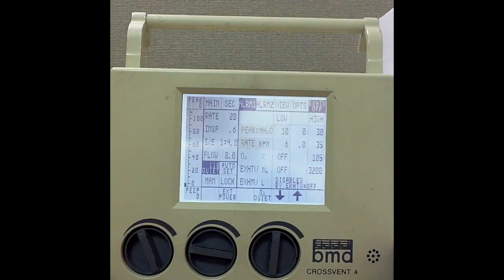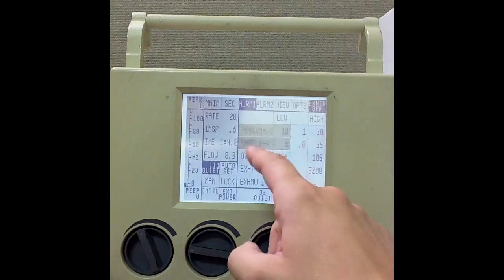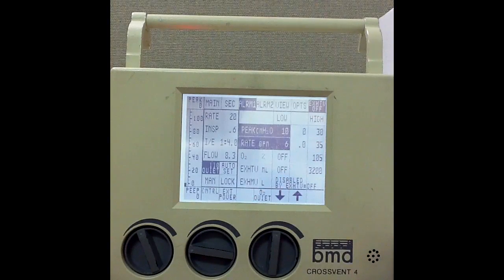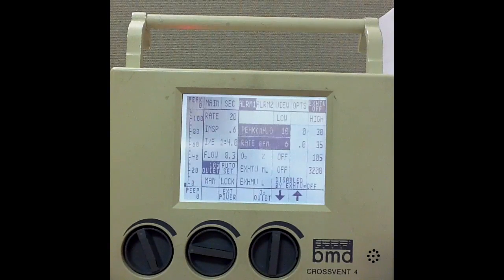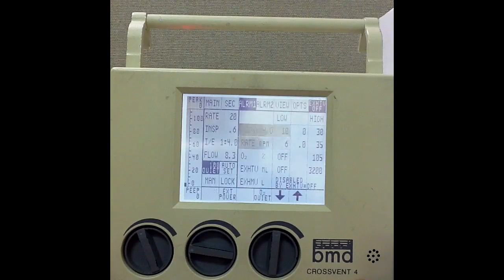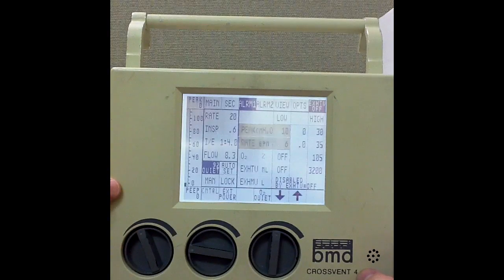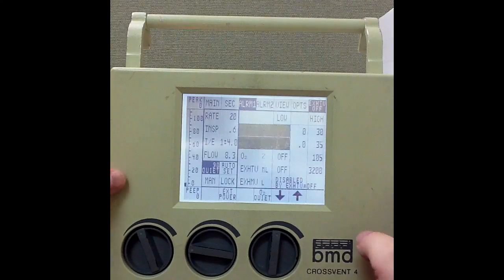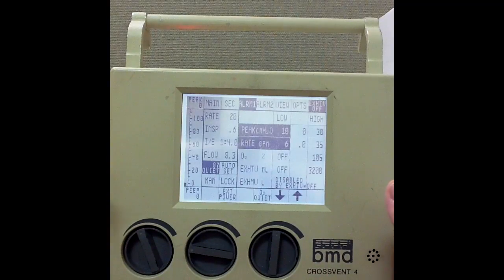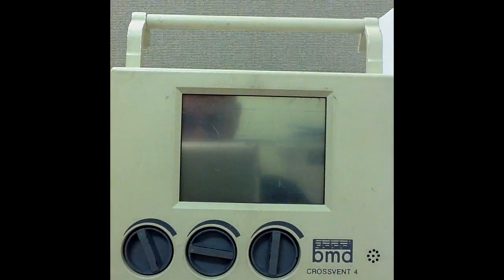That is the basics of setting up a patient in pressure control ventilation. Of course you'll need to set your alarms accordingly. In pressure control ventilation we cannot do things such as plateau pressures and static compliance, simply because all that becomes irrelevant when I'm ventilating to a pressure as opposed to a volume. Hopefully that made sense and helped those of you confused about transitioning to this ventilator. Thank you everybody, bye-bye.